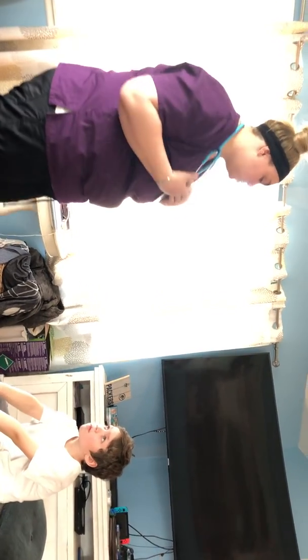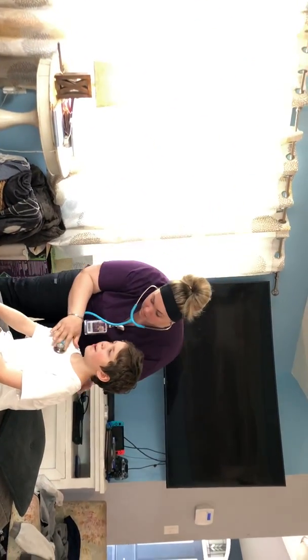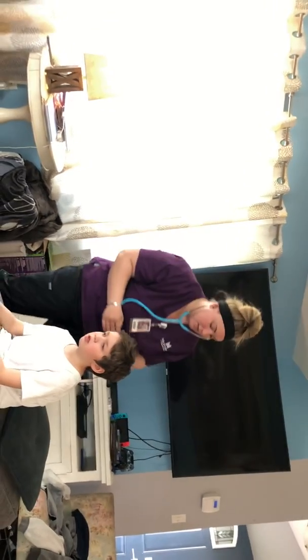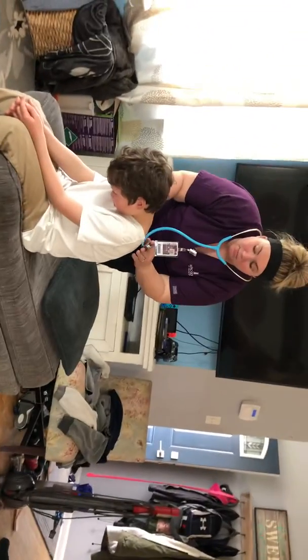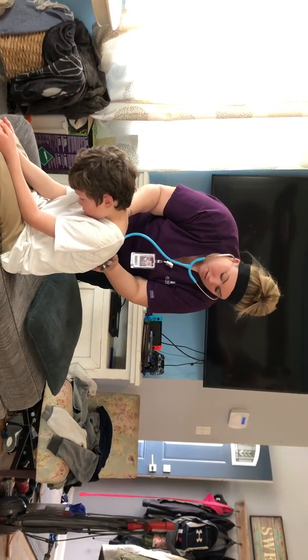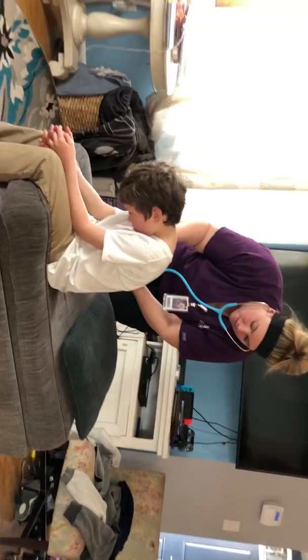Now I'm going to listen to your lungs. I'm going to listen to the second intercostal space. Take a deep breath. Okay, and then I'm going to come around. That was the anterior. Now I'm going to go posterior. Put your head down. C7 is noted. I'm going to do the upper, middle, lower, lower. All lung sites are clear to auscultation.